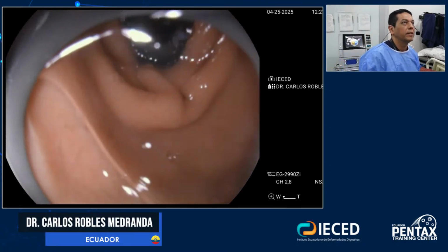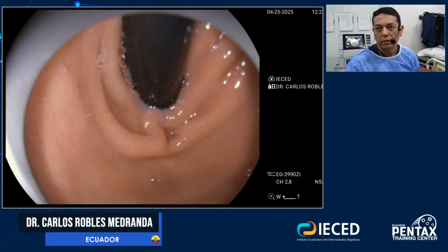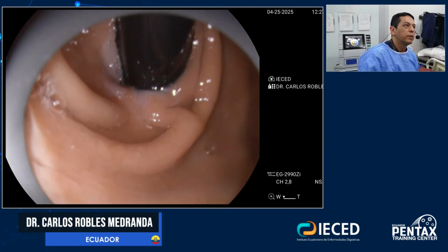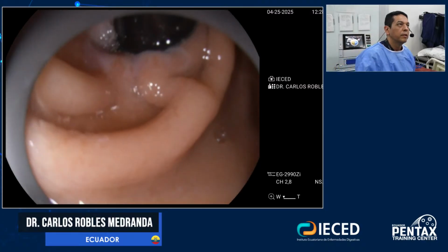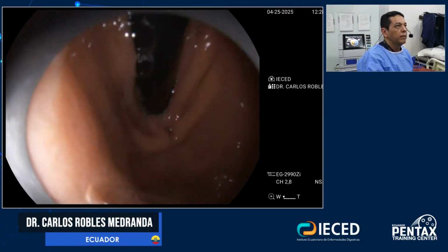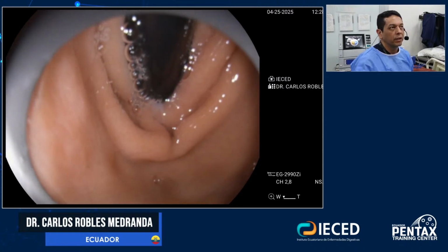Today we had a nice live transmission to Brazil, but I want to show you something that I believe can be applied in an easier way in your units when you have this kind of patient. We have a 42-year-old woman with a history of GERD.